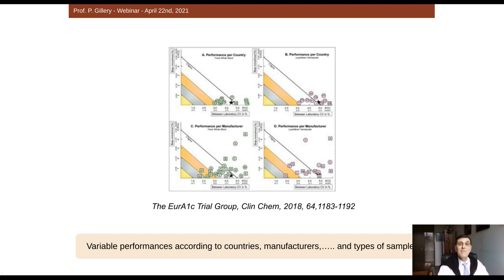This study demonstrated that there were variable performances for HbA1c assays according to countries on the top of the slide, according to manufacturers below, but also on the type of samples.